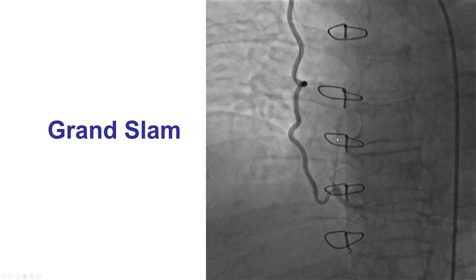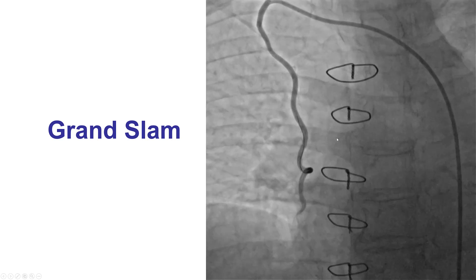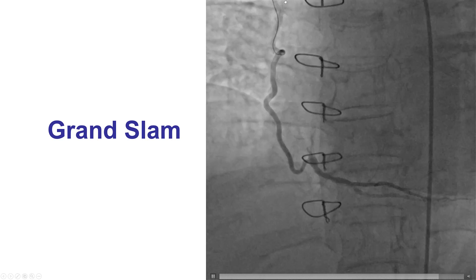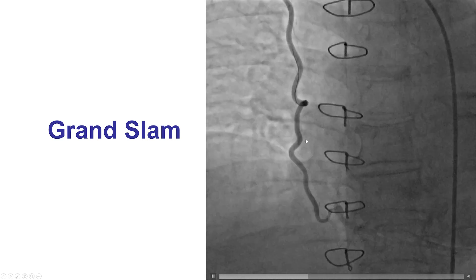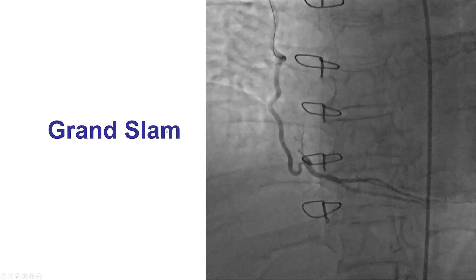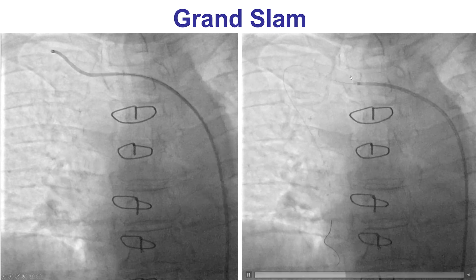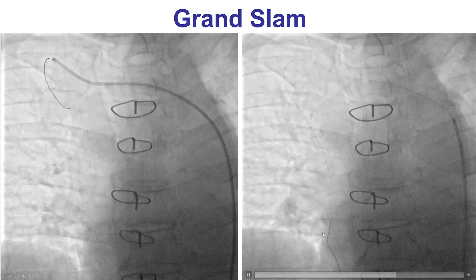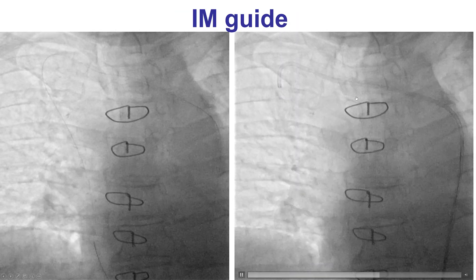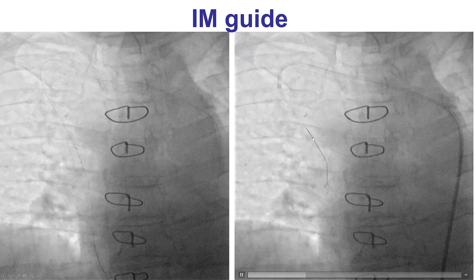We had some difficulty engaging the graft with the diagnostic catheters, which is why we decided to use the guidewire exchange technique for inserting the guide catheter. Through the diagnostic catheter, we advanced a supportive wire — a Grand Slam 300 cm wire — then removed the diagnostic catheter, leaving the supportive wire in place. Using this same rail, we were able to advance an IMA guide catheter into the origin of the RIMA graft.